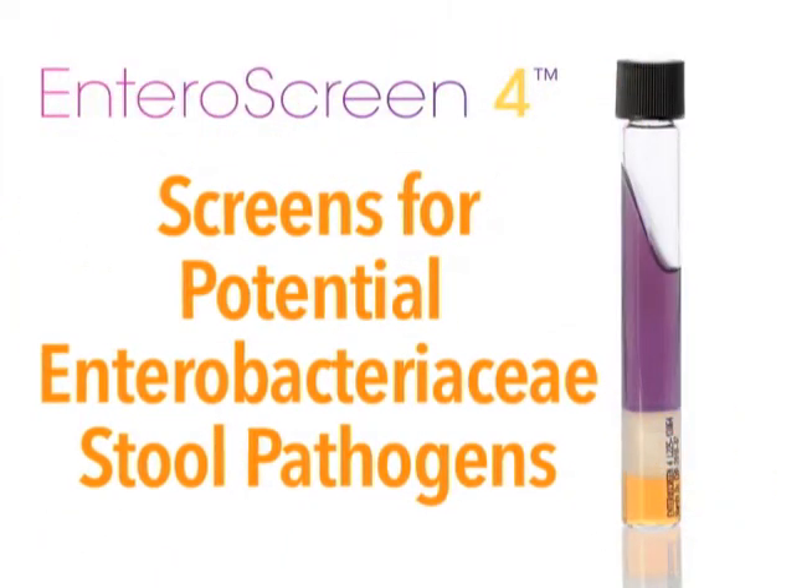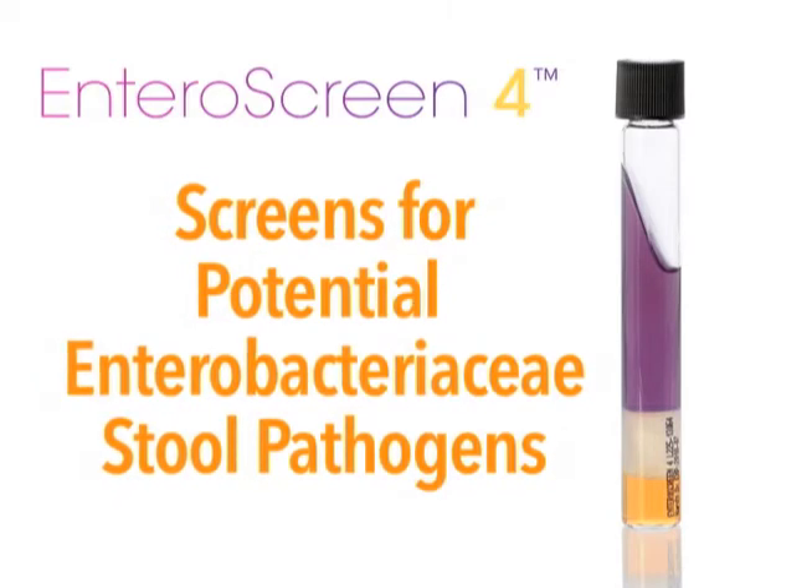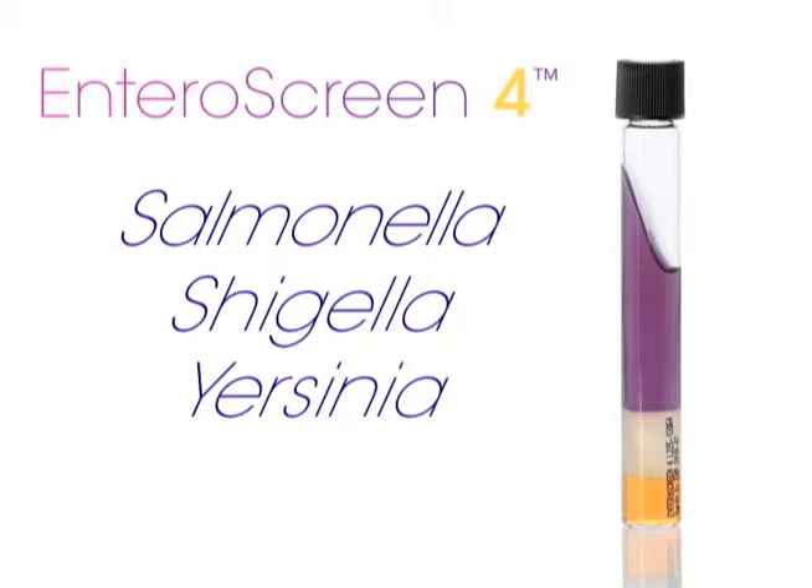Enteroscreen 4 will assist you in identifying the true lactose-negative enteric pathogens, such as Salmonella, Shigella, Yersinia, and Edwardsiella.